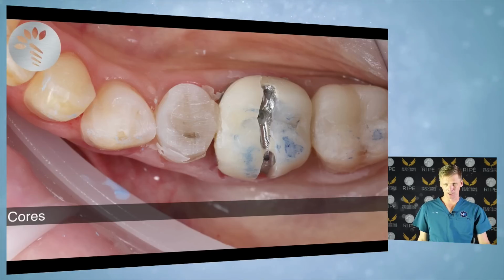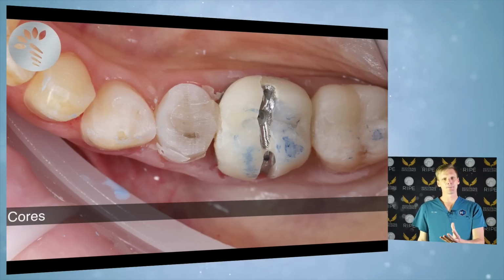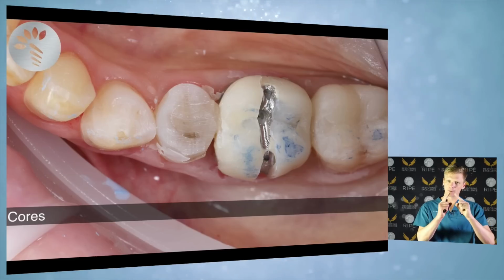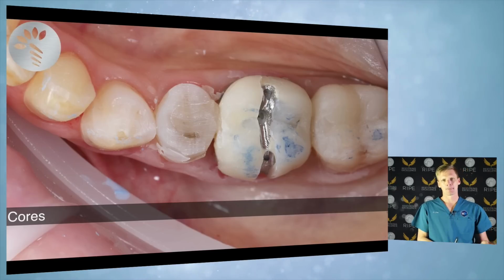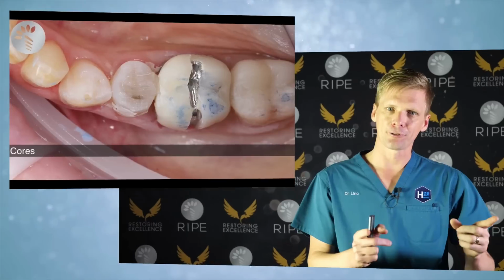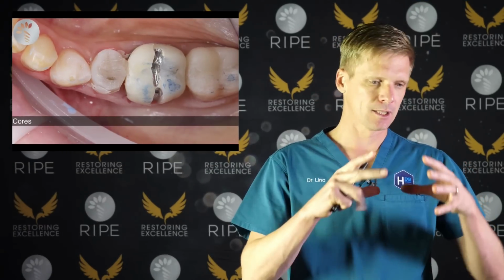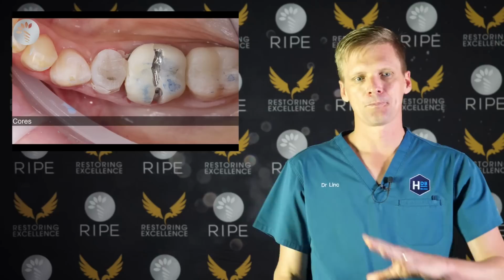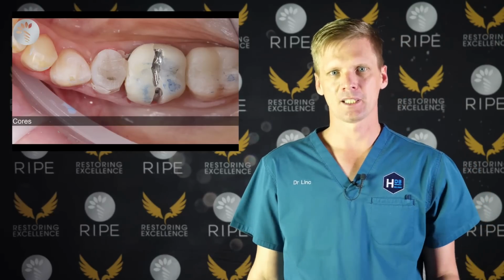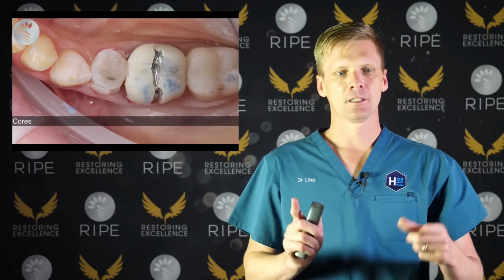Now, what if you're using an optical scanner? It's the same. A really nice, smooth prep is easy to scan without errors. As soon as you start getting really sharp points anywhere on a prep, it's hard to get silicone to flow around it, and it's hard to scan it. As soon as you start getting preps that are really rough, it's hard to get silicone to flow over it, and it's hard to get a scanner to scan it. So the core is important because it makes things smooth. Now, I guess you could just make it smooth and blobby. We'll come back to that.